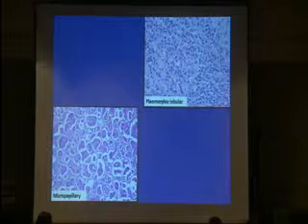And here's an example of pleomorphic lobular carcinoma. So typical or classic lobular carcinoma usually has very low-grade nuclei. However, this pleomorphic carcinoma has more pleomorphic nuclei, hyperchromatic, high N/C ratio, and you can see here the typical intracytoplasmic mucin with a signet-ring cell appearance that you can see in lobular carcinoma. This is an example of micropapillary carcinoma, and basically you see clusters of cells with a space or a clearing around them, giving it the micropapillary look.